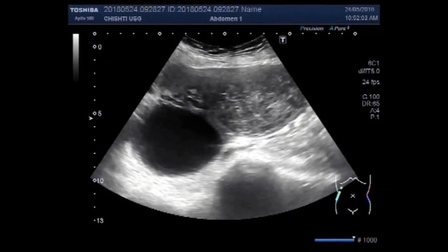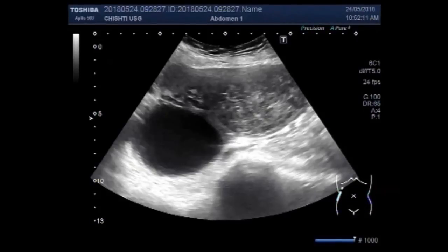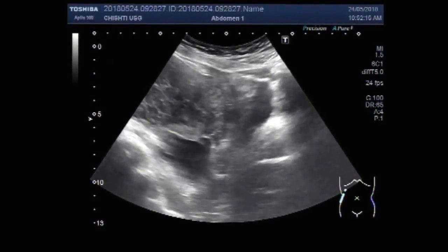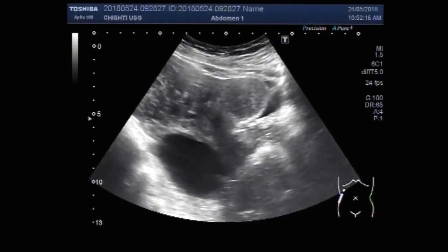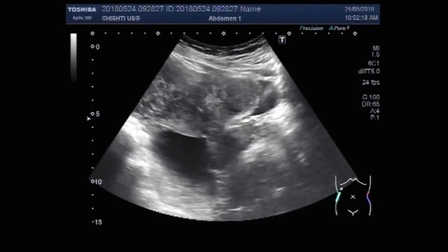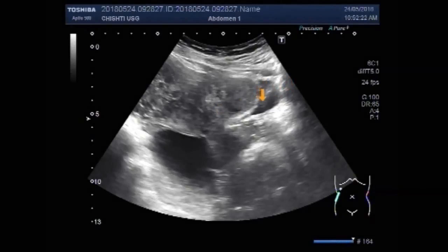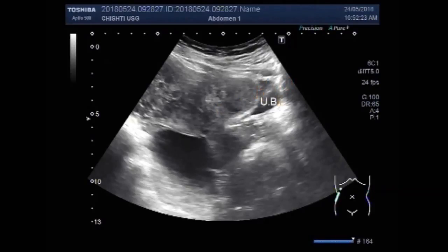Dear viewers, I hope you are all fine. This ultrasound video shows an ovarian cyst and a mass. One ovary has a cyst, the other having a mass. This is the uterus, this is the cervix.